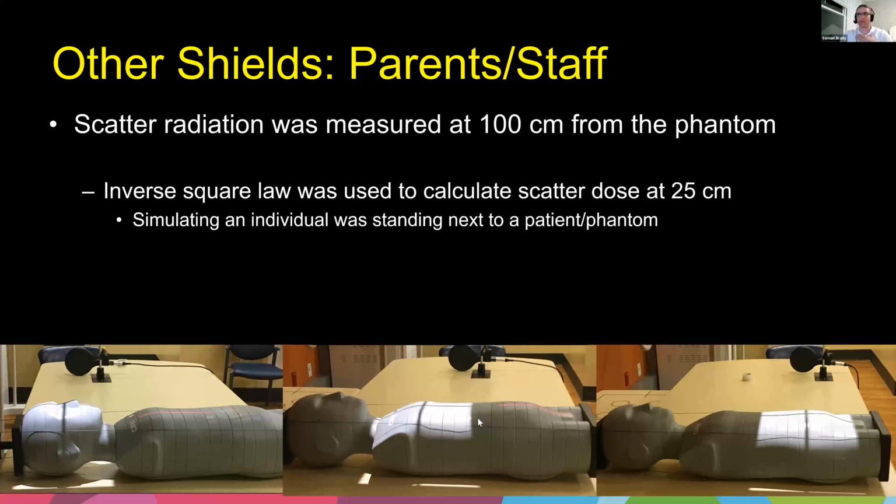In my practical experience, having tested these machines throughout my career, where you see the light is where you get the radiation. There may be just a little bit that comes out on the sides, but it's very, very small. As a medical physicist, I'm always double checking that the radiation matches the light field, for two reasons. One, the technologist needs to know that if they center the light field, then when they pull the trigger, the anatomy is going to be there. If the light field is mispositioned, you'd get clipping in the image, and the radiologist would have to reshoot the image.